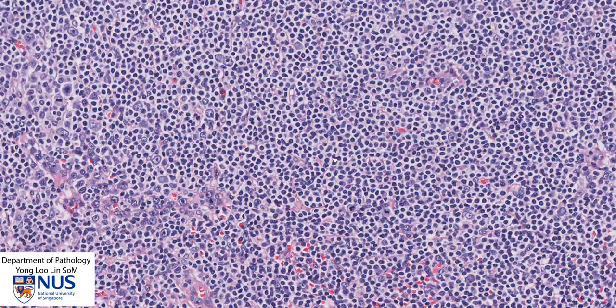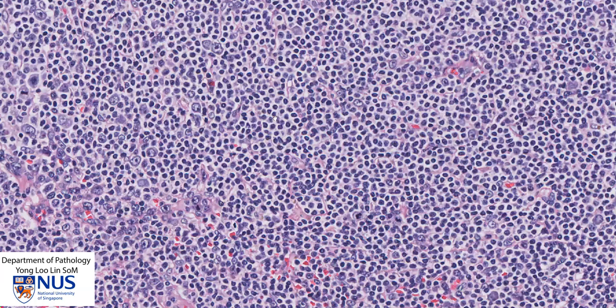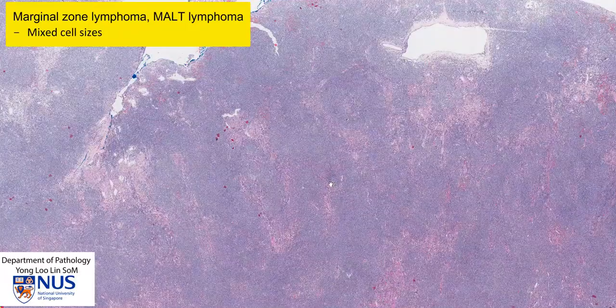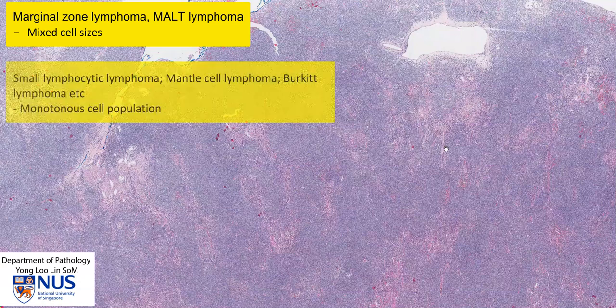We can see that the lymphocytes are quite variable in size. We have many small lymphocytes, some slightly larger medium-sized lymphocytes, and occasional even larger lymphocytes. So this population has a heterogeneous appearance comprised of lymphocytes of varying sizes. Marginal zone lymphoma, or MALT lymphoma, is a low-grade lymphoma with this classical mixed lymphoid population appearance. In many other B-cell lymphomas, such as small lymphocytic lymphoma or mantle cell lymphoma, the lymphocytes tend to be more similar to each other in size. However, in marginal zone lymphoma, there is a greater variation in size, with generally small lymphocytes predominating.